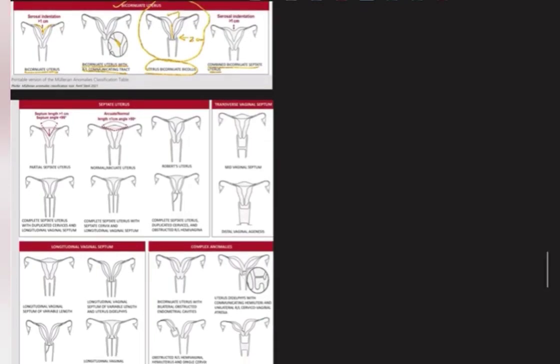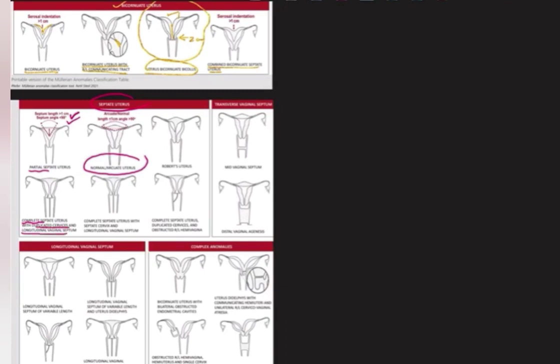The septate uterus has internal indentation more than one centimeter, septum angle less than 90 degrees, and the septum can be partial or complete. The normal or arcuate uterus has internal indentation less than or equal to one centimeter with angle of divergence more than 90 degrees. There is complete septate uterus with duplicated cervix and longitudinal vaginal septum, complete septate uterus with septate cervix and longitudinal vaginal septum, and complete septate uterus with duplicated cervix and obstructed right or left hemivagina — various permutations involving cervical and vaginal septa.